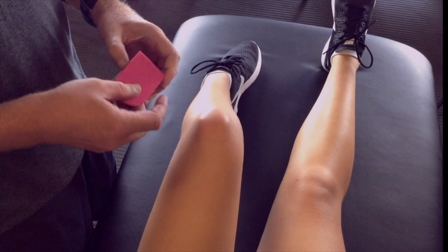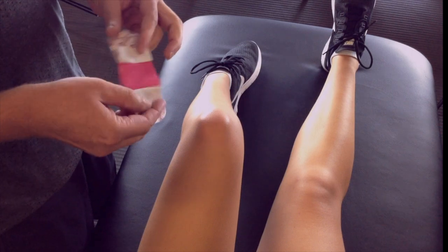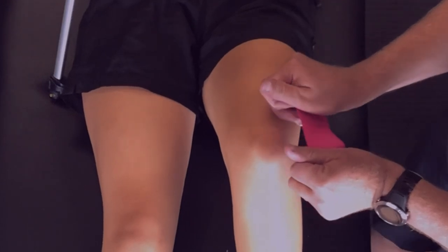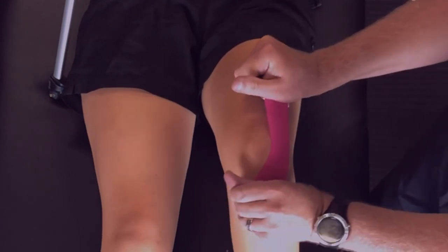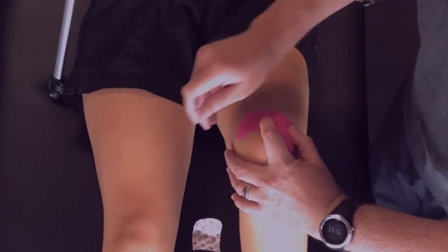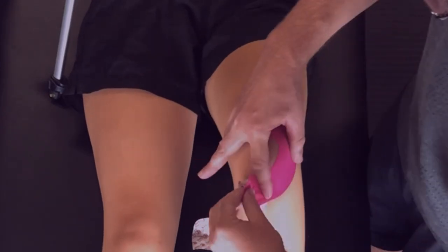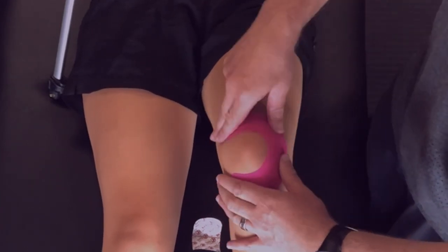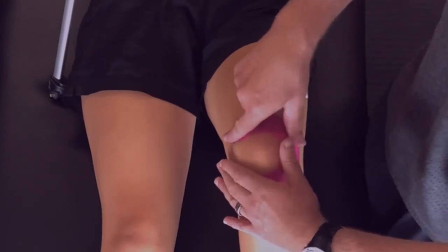Fold the tape in half and then tear the tape down the middle. Peel away a portion of the paper backing to expose the adhesive. Then stretch the tape out to its full length and place the middle of the tape on the outer border of the kneecap. Keeping full tension on the tape, bring it around over the top of the kneecap and tap it down. Underneath the kneecap, take full stretch of the tape and then stick it onto the medial side of the knee. Remember with the kinesio tape not to have any tension on the ends, otherwise the tape will roll off earlier.